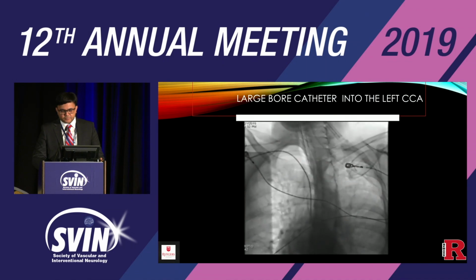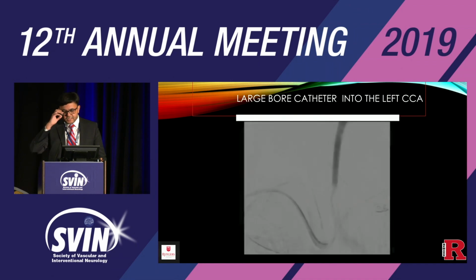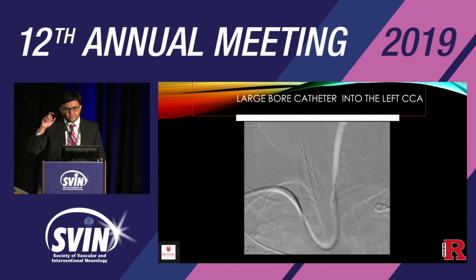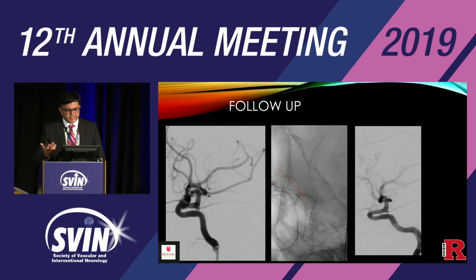Then we're forming the SIM over the aortic valve. And then we catheterize the vessel. One trick here also, sometimes the SIM will not go up easily. So what you can do is just track the Infinity over the wire. Don't fight the SIM to go up all the way. You can just track your guide all the way up over the wire, and it goes very nicely. And then you can track an intermediate catheter if you have to, if you're going distal into the ICA. In this case, we were fortunate that the SIM went up easily and the catheter was there. So this was the pipeline case. We deployed a pipeline, and at 6 months, the pseudoaneurysm was gone.